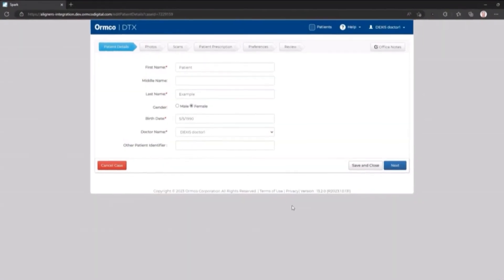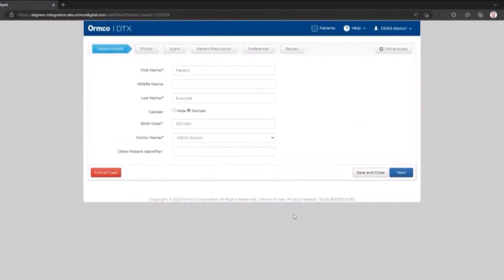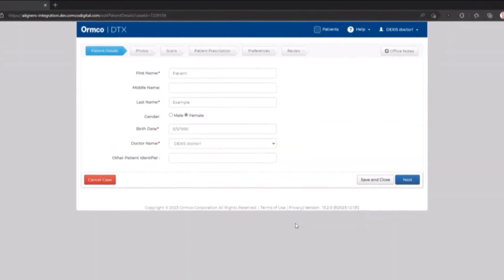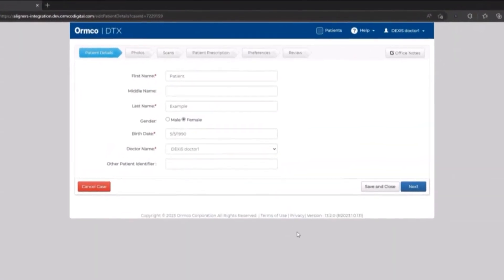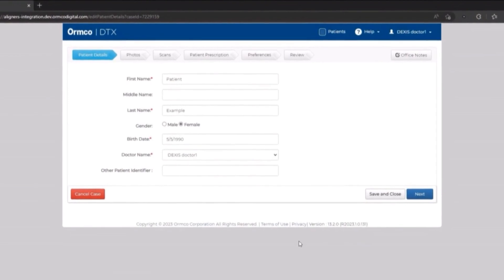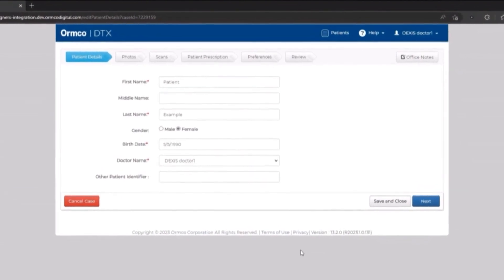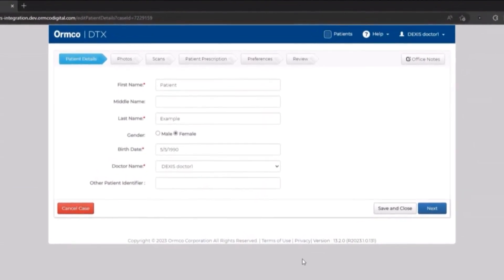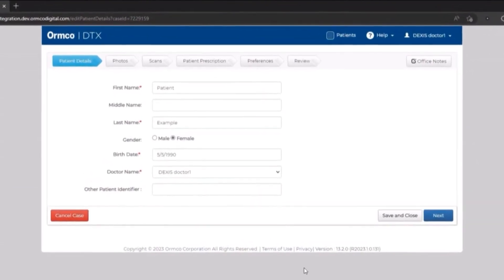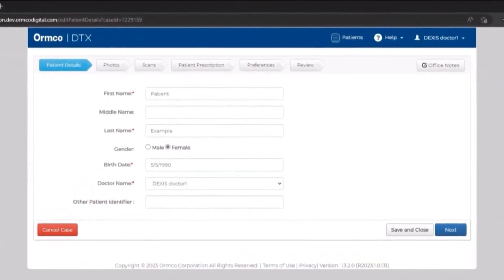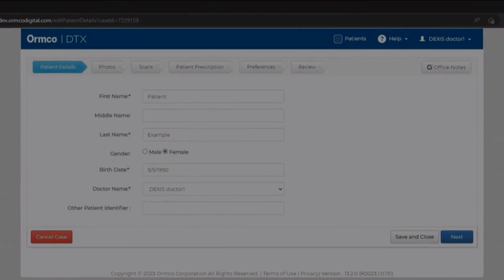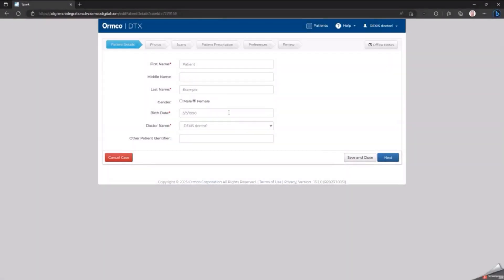The Spark Portal will automatically open. Users will not have to sign in. The Patient Detail window is displayed. Confirm that the patient's information has been transferred correctly from Dexis IS ScanFlow.